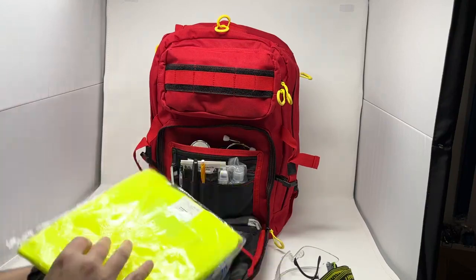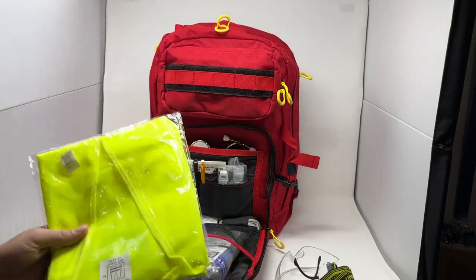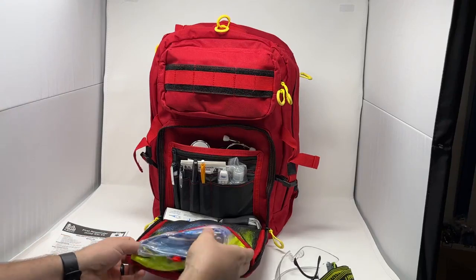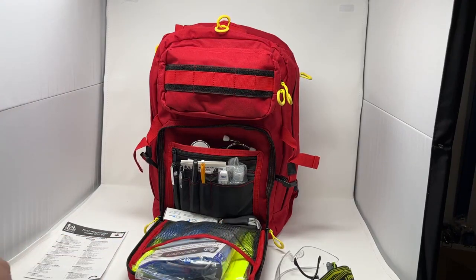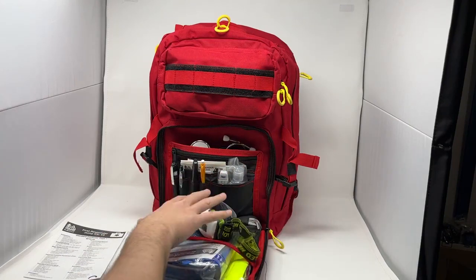Back here we also have a high visibility vest. Your highest kind of response risk is predominantly responding to motor vehicle accidents, so this is going to allow you to be highly visible if you're around any moving heavy machinery. That's the bottom pouch.